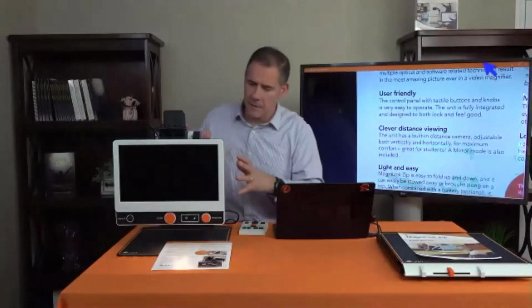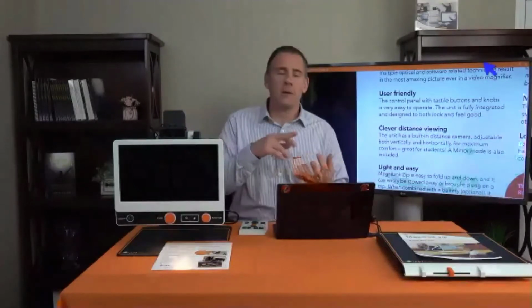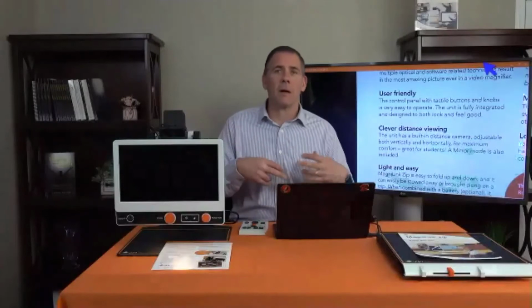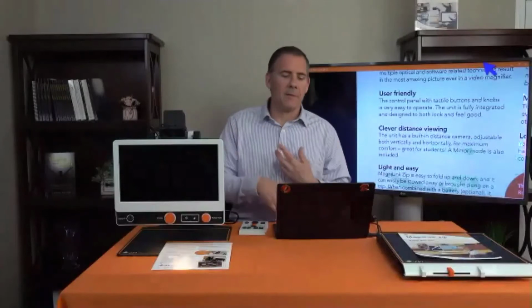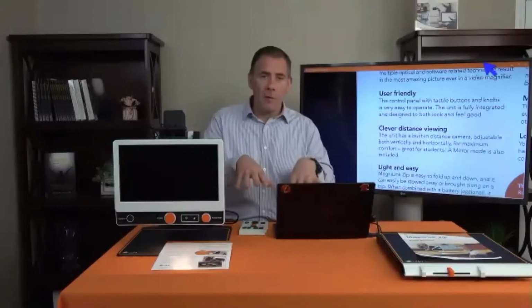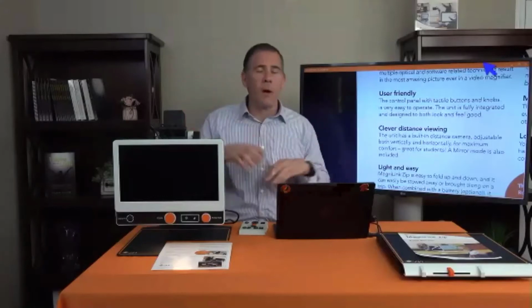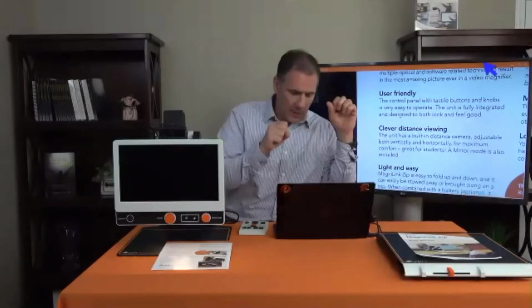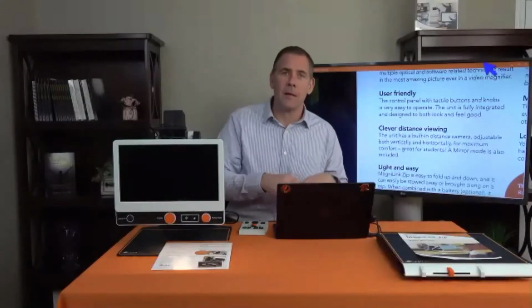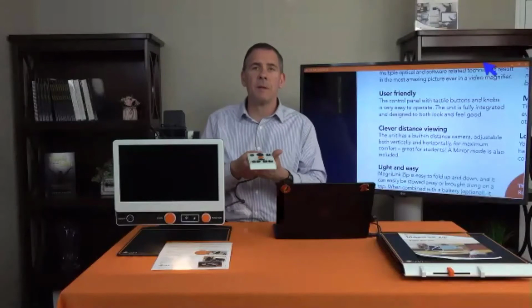And now I can run this entire device from this computer. I can do all my magnification, all my modes. And when I OCR, I can do all my reading speeds, and I'll show you that. So now I don't even have to touch this. I have to put paper under it, put things or focus it where I want to, and then I can activate the function from the keyboard. If this wasn't plugged in, I could use the front buttons too. But now that this is plugged in, it takes priority.